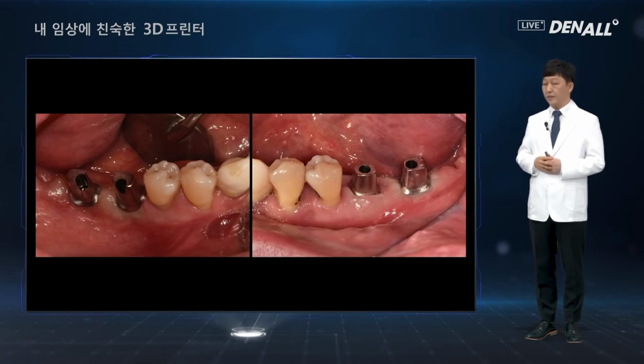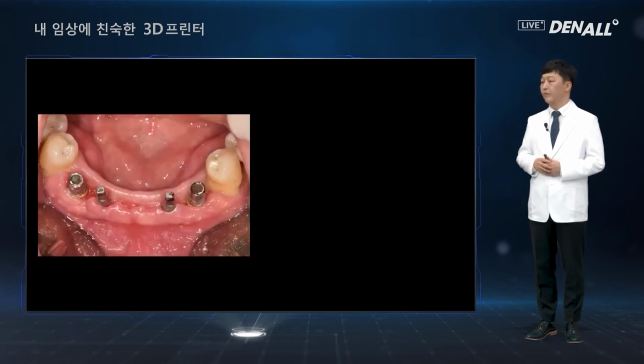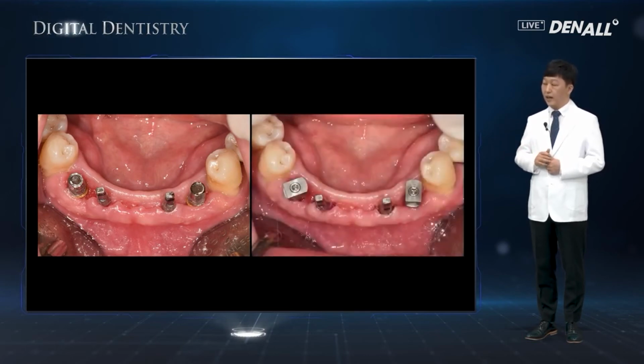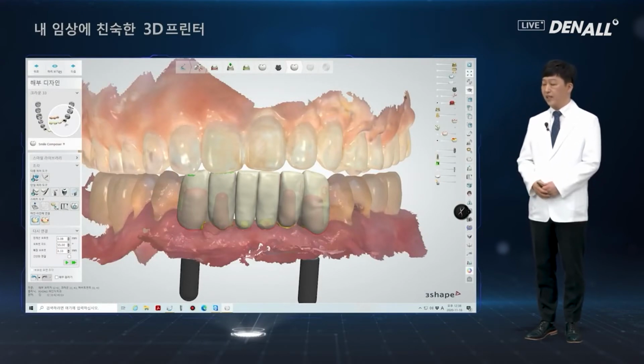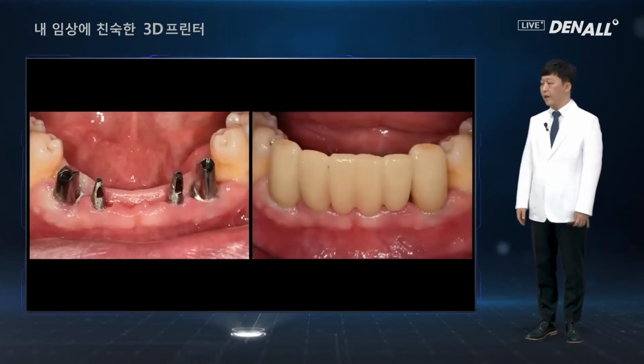The individual abutments were mounted first before the final prosthesis was delivered. In the anterior region, after the posterior prosthesis is completed, the anterior part is fabricated separately. The temporary denture that had been used was removed. Ready-made abutments were removed and scan bodies were connected to acquire the scan. Canines, anterior teeth, and custom abutments were designed, and the custom abutments were mounted before mounting the final prosthesis.